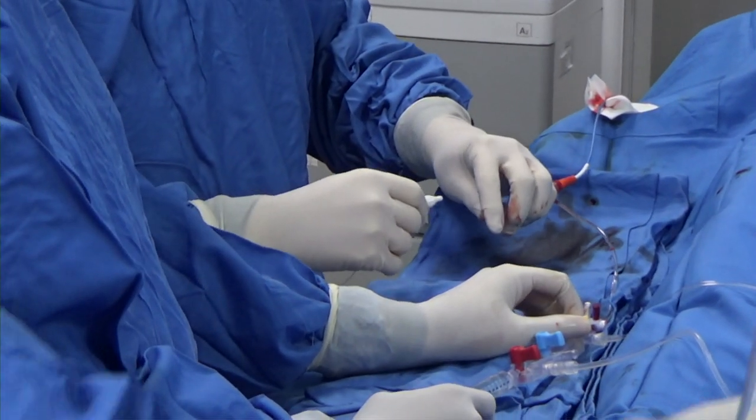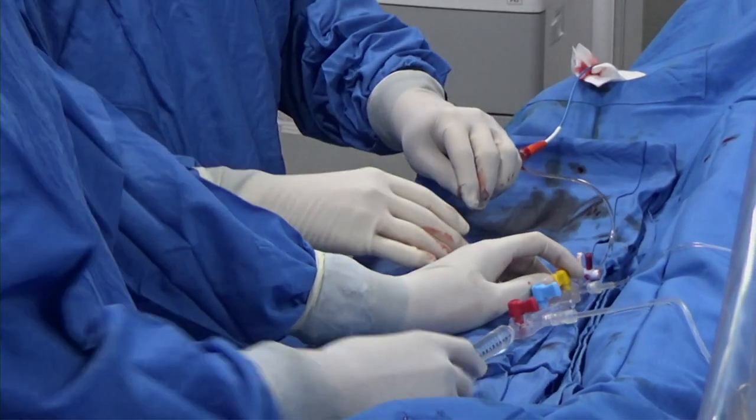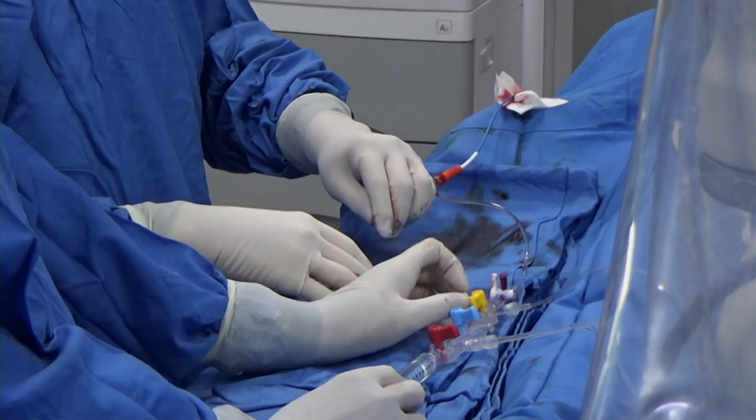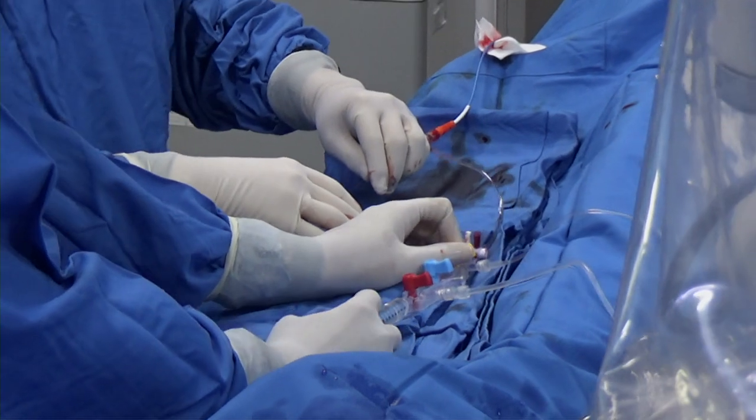Yes, I think so. So Sanjog, while they're getting ready, you can tell us what you think about IVUS of the ostium and how you get coaxial, and any risk of getting the area wrong if your IVUS isn't aligned well. Shall we take a picture?